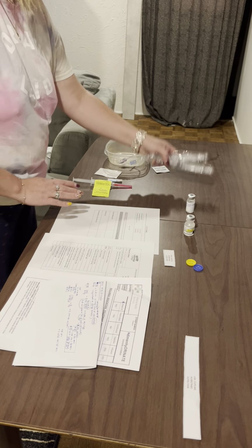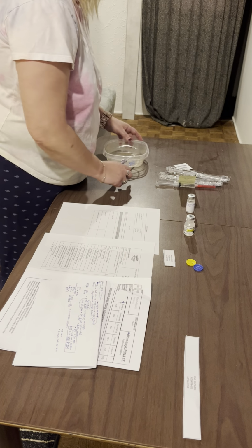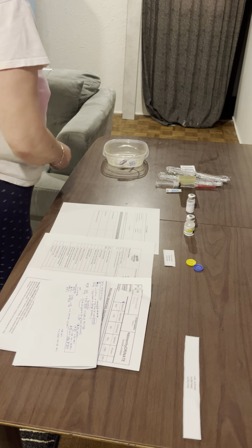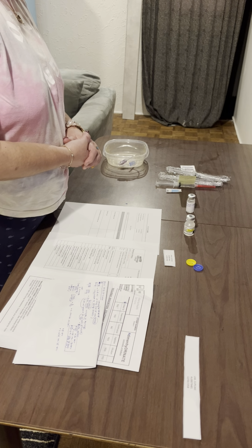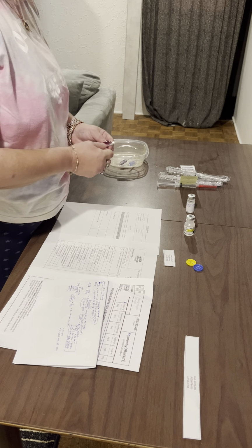We have our flushes here. We have our alcohol swab here and our cap here. Okay, so the next thing that we're going to do is, because we don't do red at bed, we are going to take the needle off and replace it with the cap.